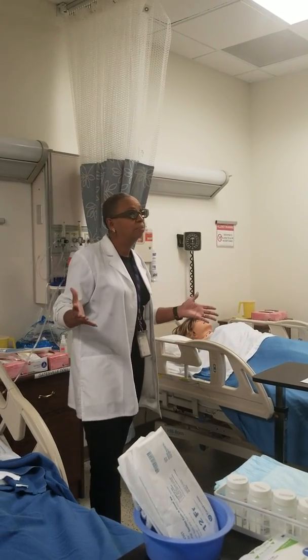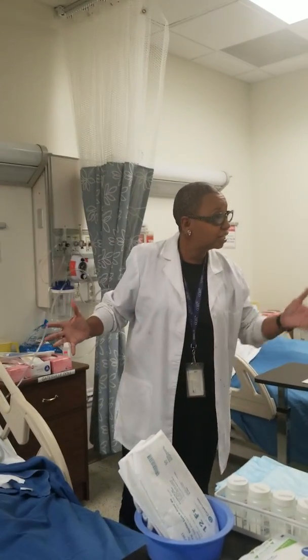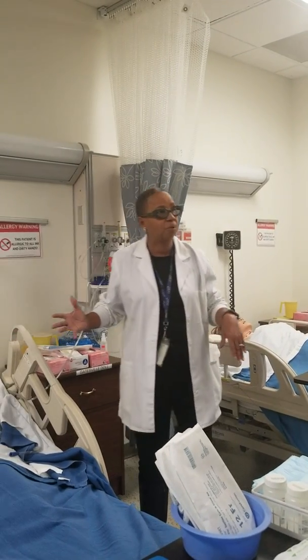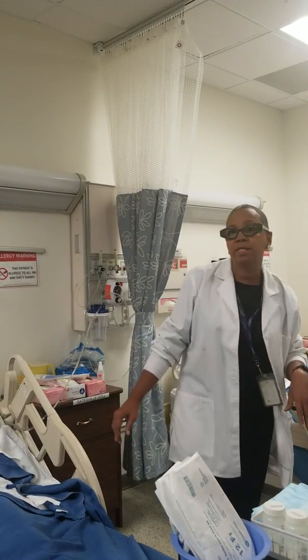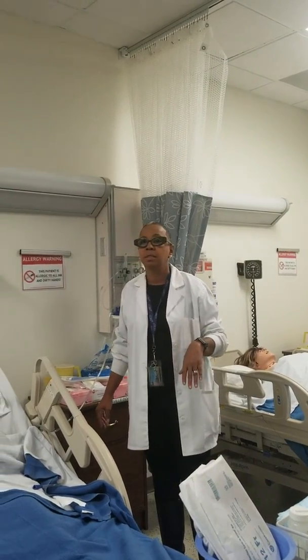What am I looking for? If you're in any type of distress, absolutely. What else am I looking for? O2 sat. O2 sats, that's right. Do you have a pulse oximeter on you? What else am I looking for? If the patient was talking previously and now they're not.